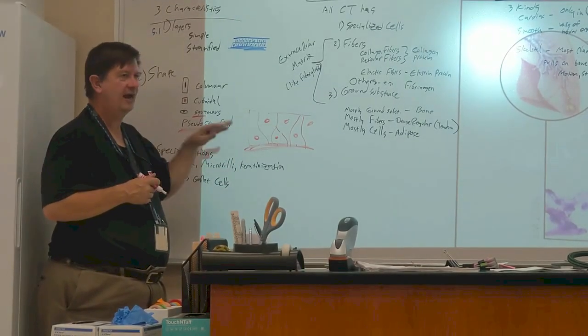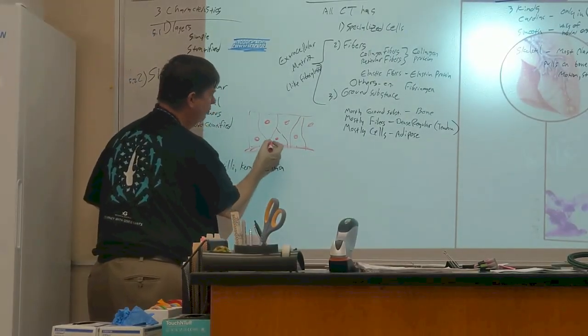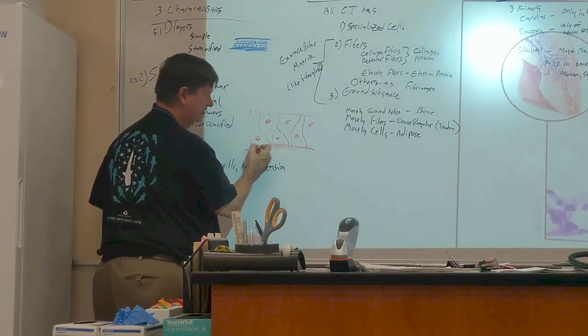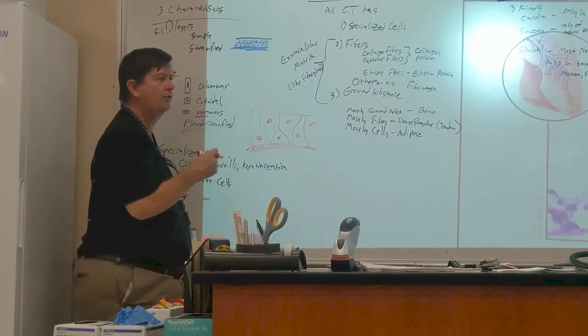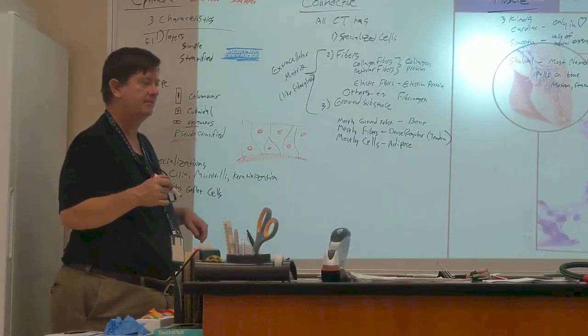How do we know this is actually a simple tissue? Because all the cells, even the ones that are barely attached, are attached to the basement membrane. The ones that are broadly, strongly attached, they're attached to the basement membrane. The ones that don't even reach all the way up to the apex, they're attached to the membrane. They're all on the same membrane, so they're all the same layer. It's pseudo-stratified. Are you with me?